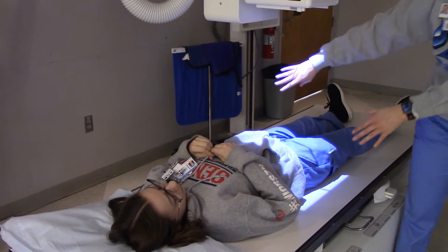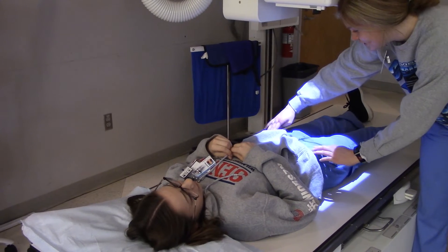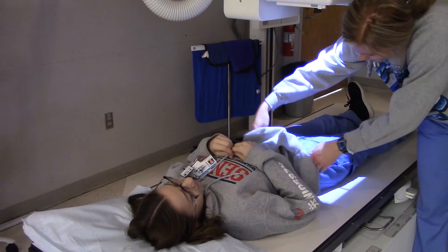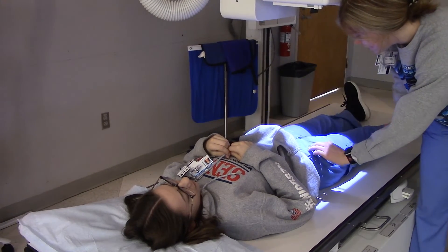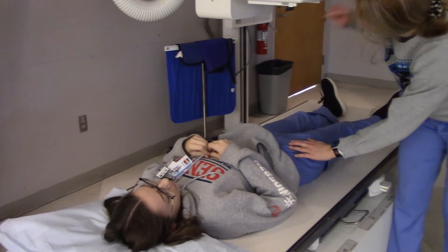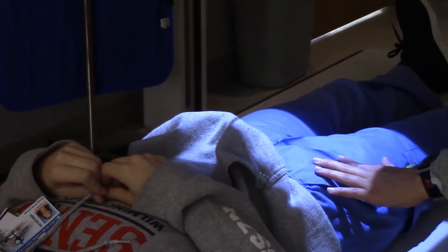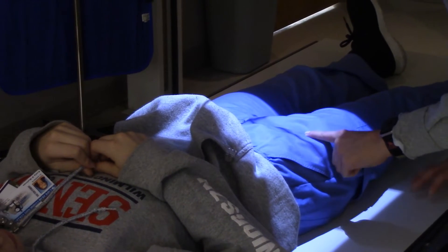Now we're going to palpate our patient. Just grab that patient. We're going to find our crest. Now we already did our AP pelvis, so you're doing your frog leg pelvis? Yes. Very good. So now we're going to go about three inches below — one, two, three inches — probably about right here.